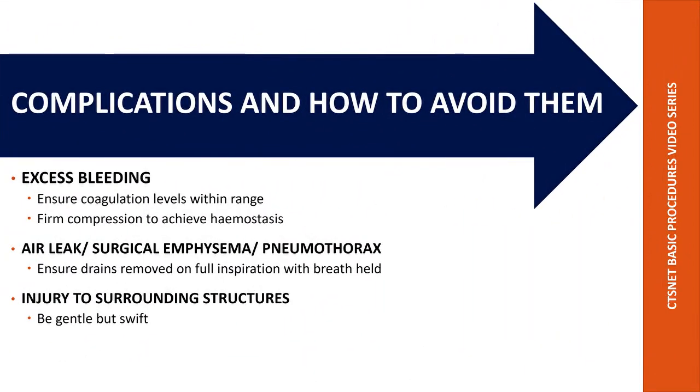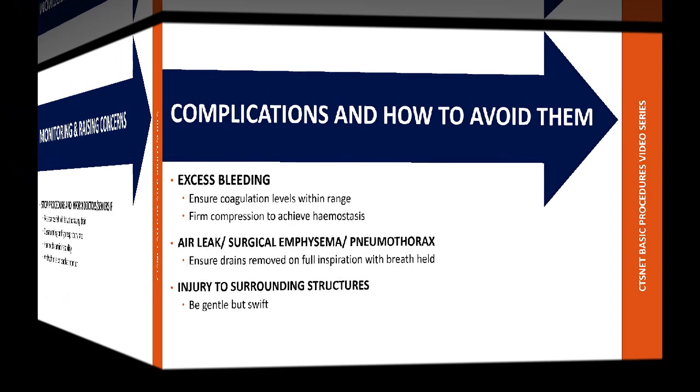Excess bleeding is avoided by ensuring coagulation levels are within range and with firm compression to achieve hemostasis. Air leaks, surgical emphysema, or pneumothorax can be avoided by ensuring drains are removed on full inspiration with the breath held. You can avoid injury to surrounding structures by being gentle yet swift.